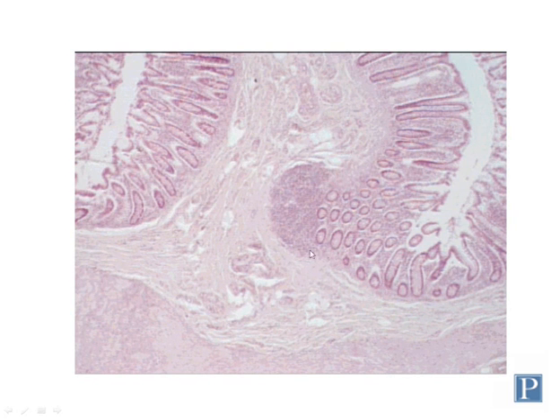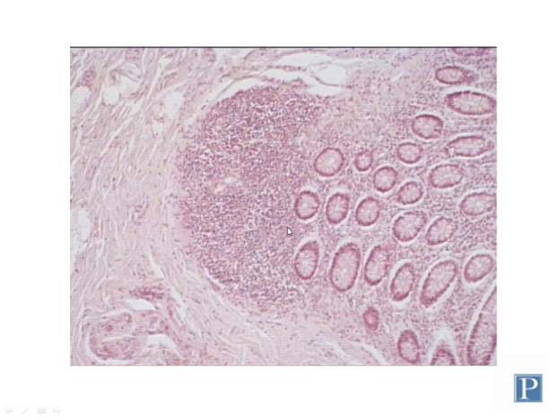So this is a solitary lymphoid nodule right here. This is in the gut, in the colon. Here you can see glandular tissue of the colon. We're going to look at this in more detail next week. Underneath the glandular tissue, in the region that's still part of the mucosa or the submucosa, is a good place where you can find these lymphoid nodules.